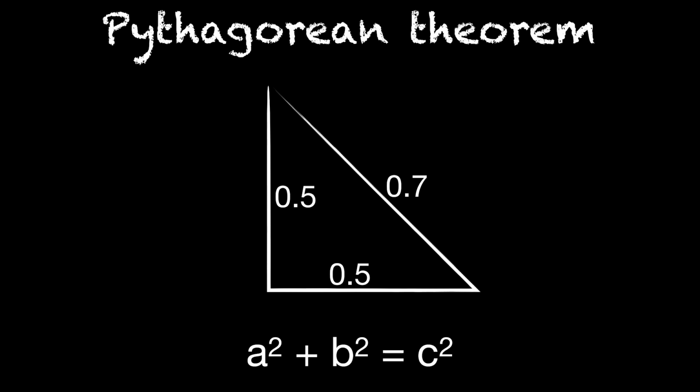So for instance, if we have a vein that's half a centimeter deep, then we're going to have to travel about 7 millimeters of catheter just in the subcutaneous tissue before we even hit the vessel. So picking a catheter that's only a centimeter and a half would not be ideal. You would typically want to go with at least probably a 33 millimeter catheter, or about 1.25 inches, to get there.